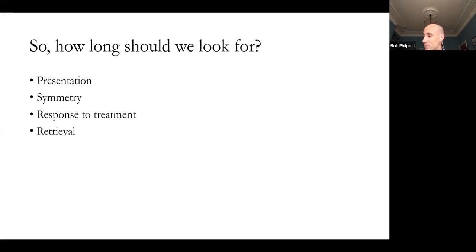I look at the patient's response to treatment, and I think the person who asked me this question highlighted this quite nicely, where they had said they just dress with calcium hydroxide and they'll reassess, and that is a totally sensible approach. Because if I have an upper six and I'm looking for 45 minutes for an MB2, and the patient has a buccal sinus and I can't find it and I dress with calcium hydroxide and they come back and the sinus is gone, chances are you're on the road to healing. I'm not saying it's going to continue that way, but it's a very sensible approach to take.